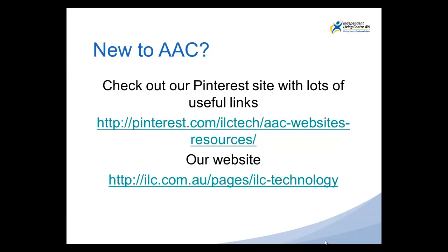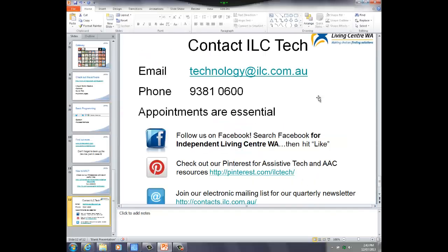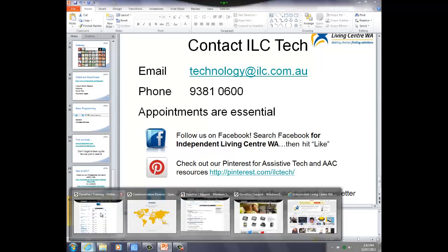If you're new to using augmentative and alternative communication, or you'd like some general information, you can certainly head to our Pinterest website with lots of useful links about AAC resources, or head on to the ILC technology website. I'll just quickly head out now and show you the Dynavox website.